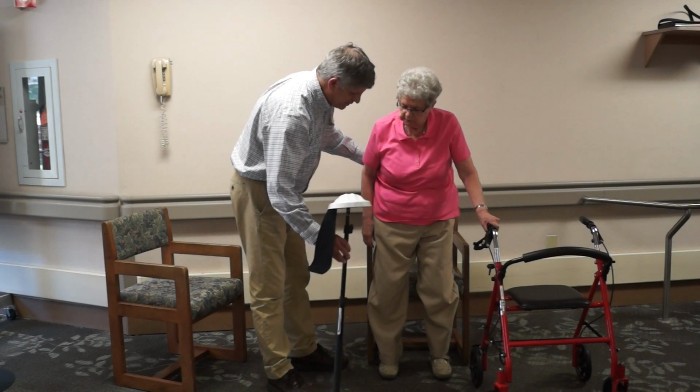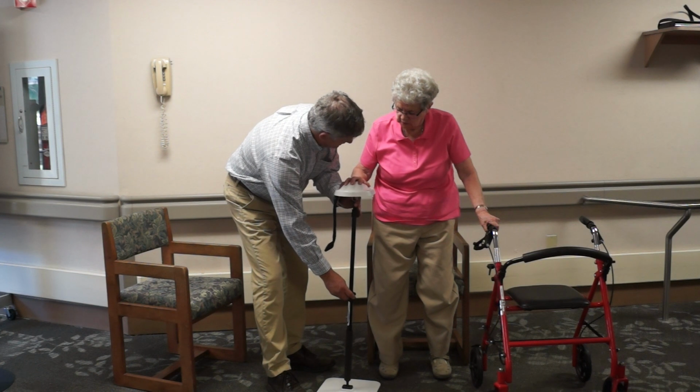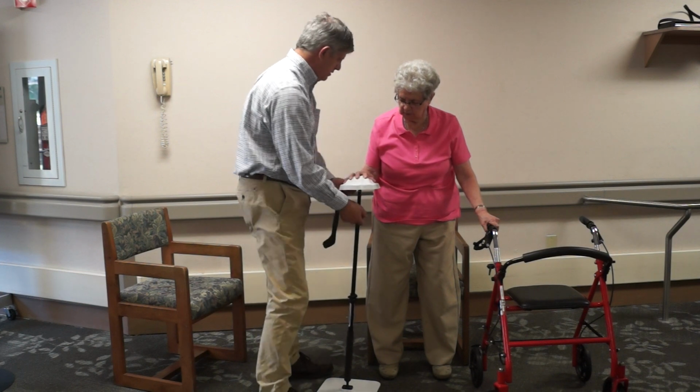Now I'm going to bring this underneath you again, okay? But we're going to do it in standing the entire time. So I'm going to get this up to just about where your elbow's at 90 degrees, okay? Yep.